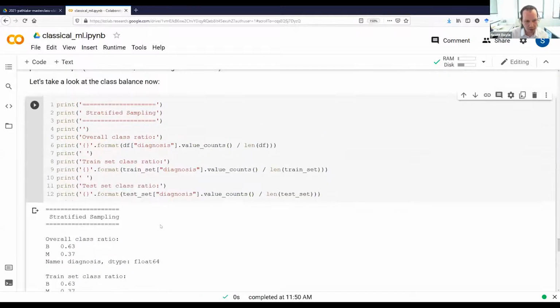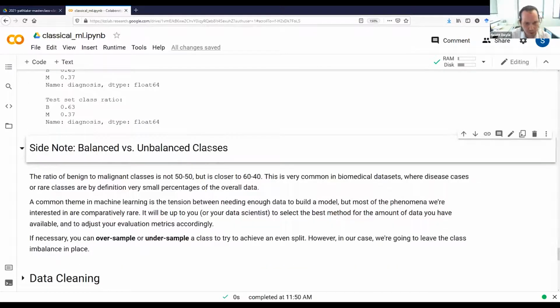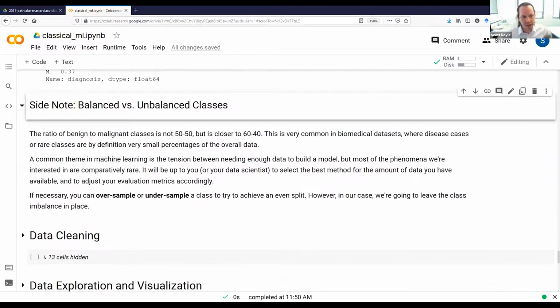And this is important because, again, we're trying to generalize. So if in the universe there's twice as many benign cases as malignant cases, then when we report things like accuracy, we want to be able to contextualize what that accuracy means. And Abhir mentioned this before, depending on your classifier, you can handle balanced and unbalanced classes differently. There's a bunch of different strategies.